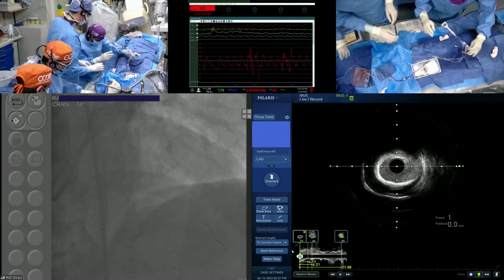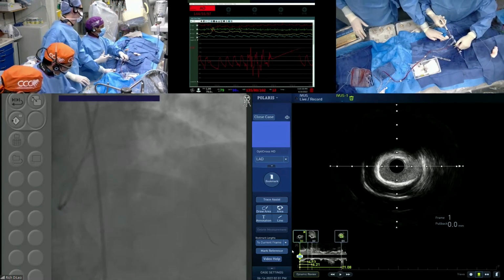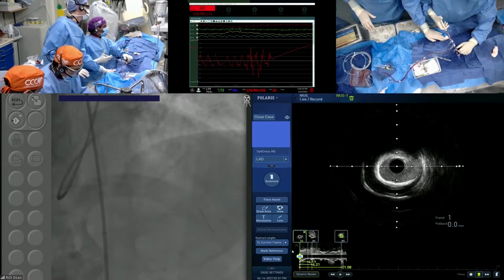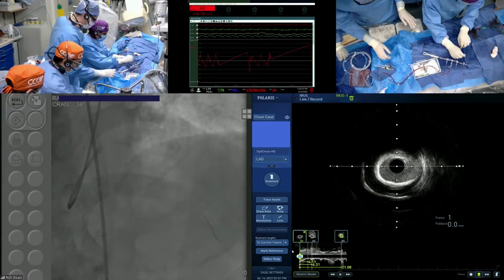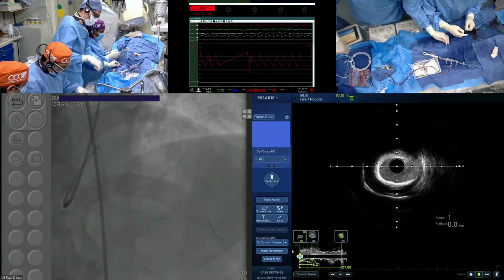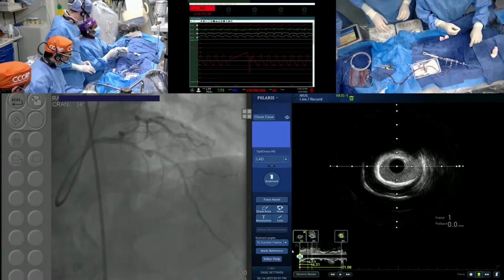All right, so let's see. Another question: how do you treat aneurysms like that? Right now we don't have any good covered stent, nothing labeled for that. Do you leave those big aneurysms by themselves, or do you cover them if you had a good device? In this particular case, as you saw, there is a lot of disease distally, even after the aneurysm. Look at the calcium.